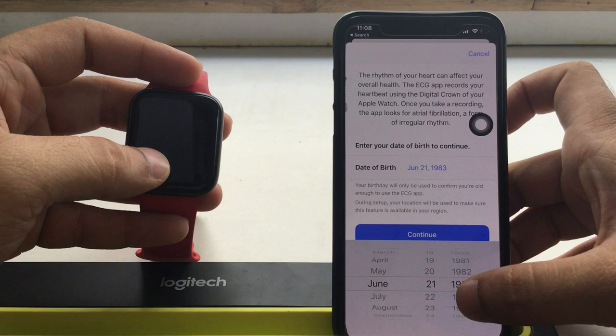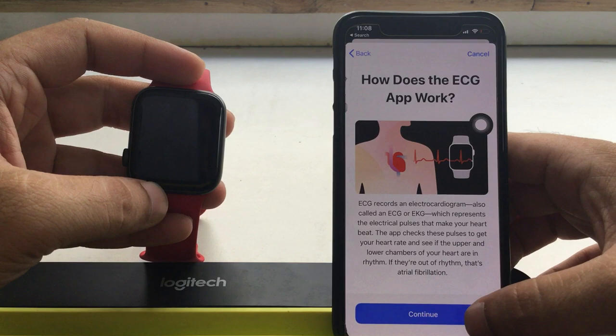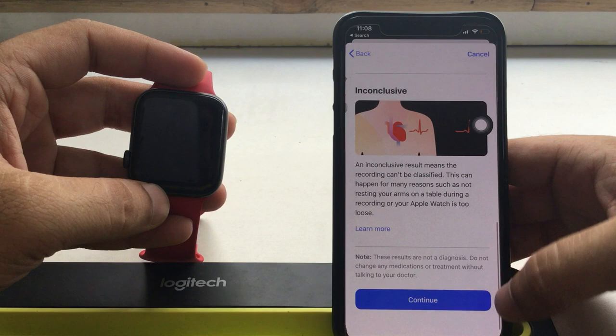How does the ECG app work? Basically, Apple Watch measures electric pulses that make your heart beat. The app checks these pulses to get your heart rate and see if the upper and lower chambers of your heart are in rhythm. Keep continuing on your iPhone screen.